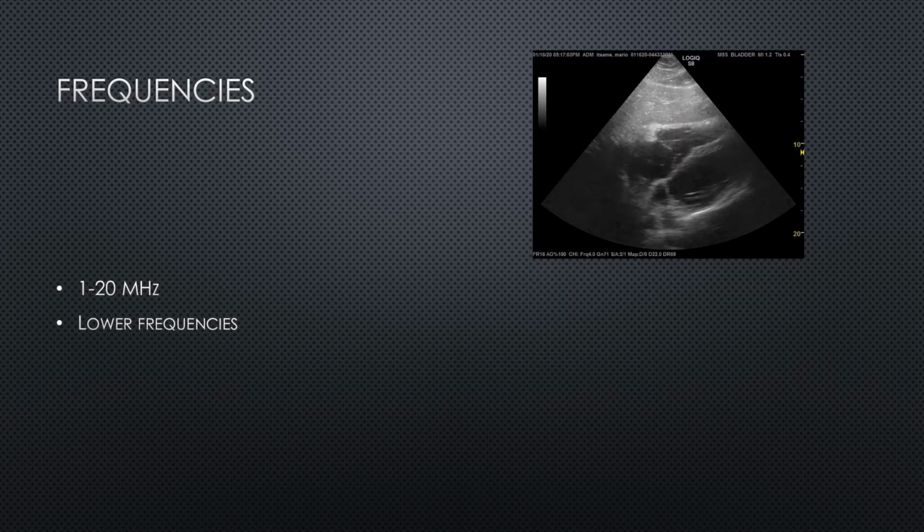So here you have an example of a cardiac ultrasound using a phased array probe. The depth over here is down to 20 centimeters, and you're getting really good image resolution for the vast majority of the screen. Everywhere that you're looking, you can see everything super clear. On the other hand, the first few centimeters up here aren't super clear. And that's one of the downsides of having one of those low frequency transducers, is that they just don't get very good resolution in the near field.